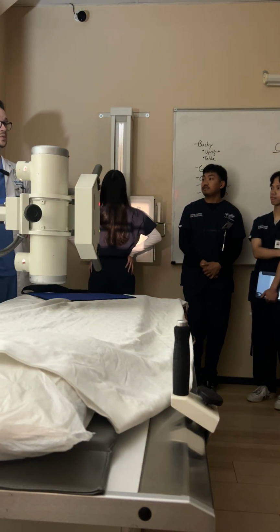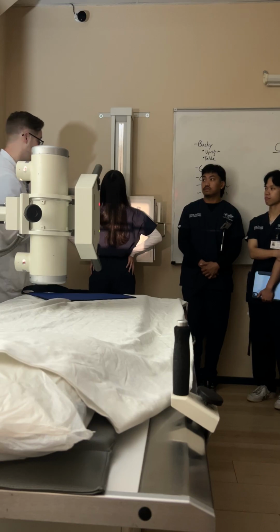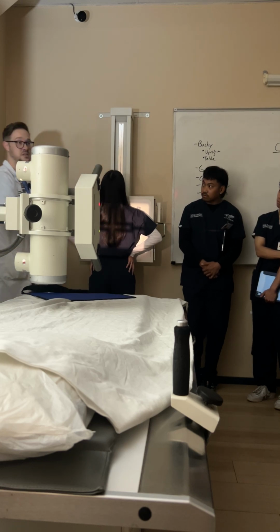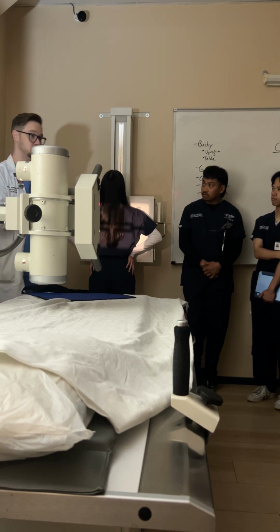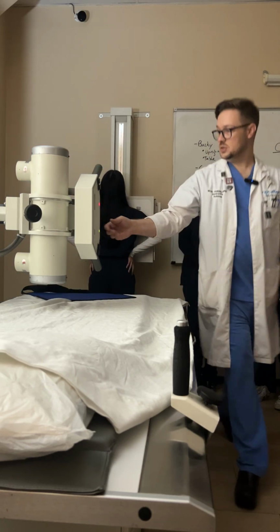Great. What's the other thing we need to worry about with our centering? What other centering point do we need to be on? Mid-sagittal plane. Absolutely right. So I'm going to move her hair slightly. I'm going to palpate her spinous process on her T-spine to make sure that she is nice and centered. Okay? So we're good. Collimation looks good-ish.